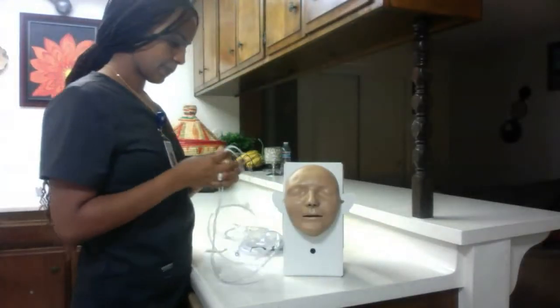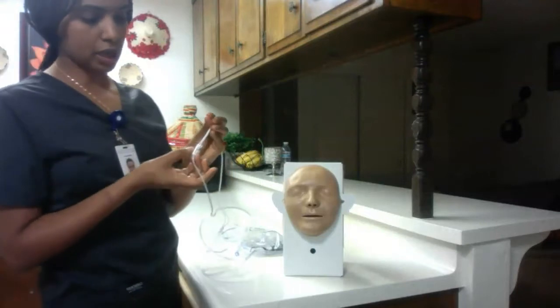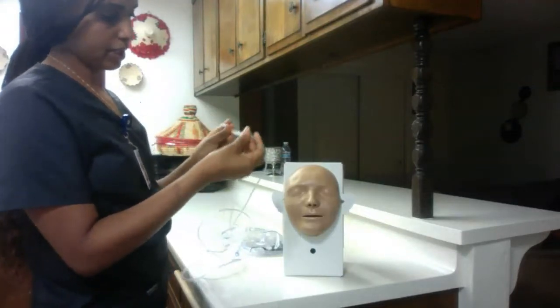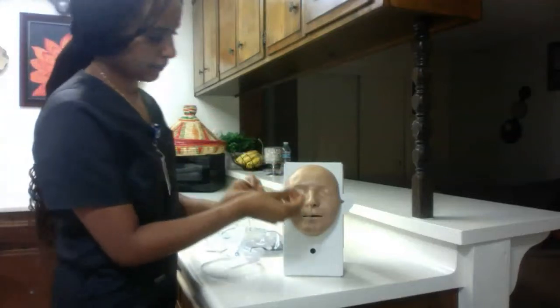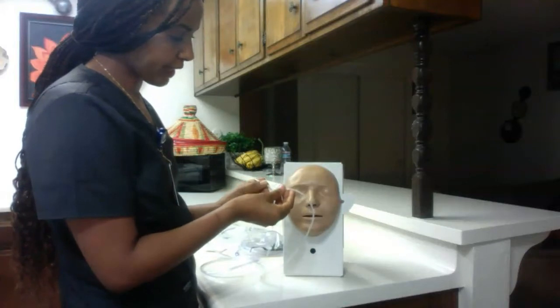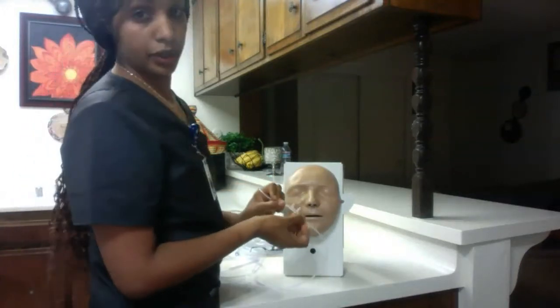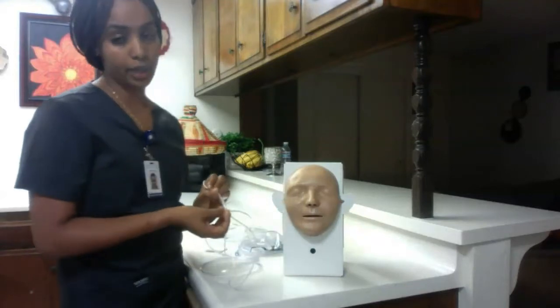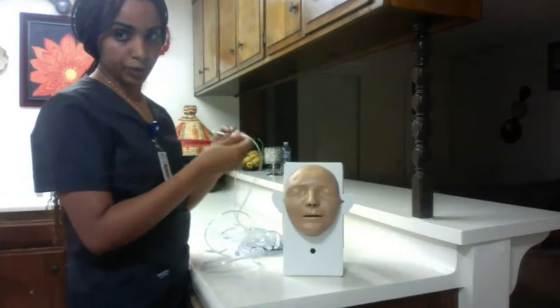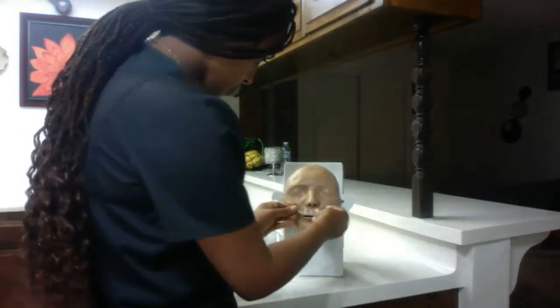Make sure the prongs go inside the nose, not outside, because we want the oxygen to go in. And make sure you don't turn it backwards, because if we do the oxygen is not delivered properly — that might cause dryness and it's going to cause some skin issues. So we're going to put it inside the nose like this.